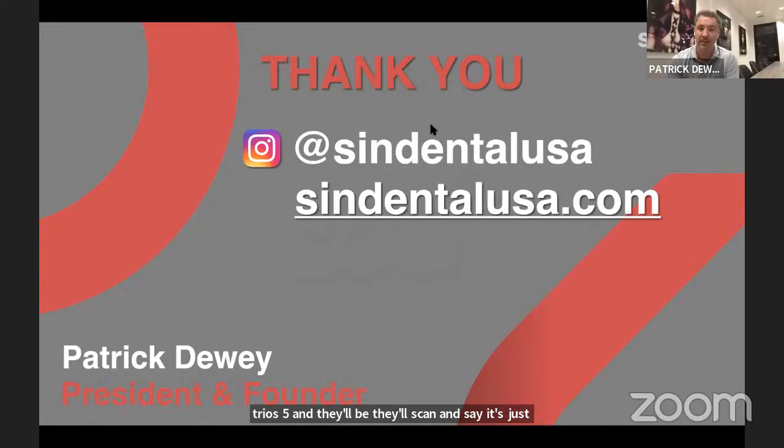We'll check their specs on their computer. Immediately when we plug them into a new laptop with the same exact scanner, it performs night and day difference better. So a lot of times people don't have to buy another scanner. They just need to upgrade their computer. So that's the first thing we check.